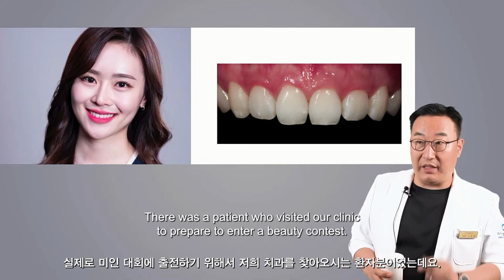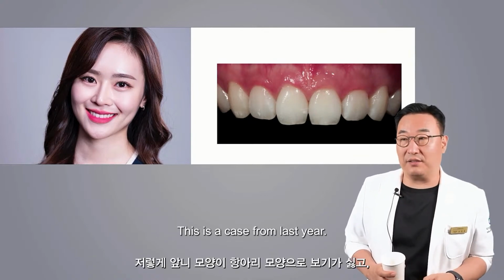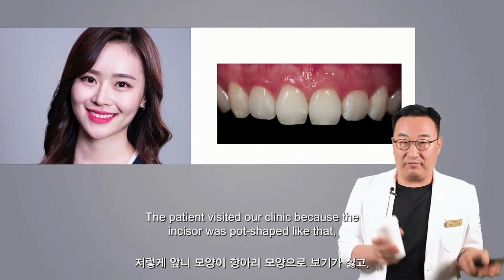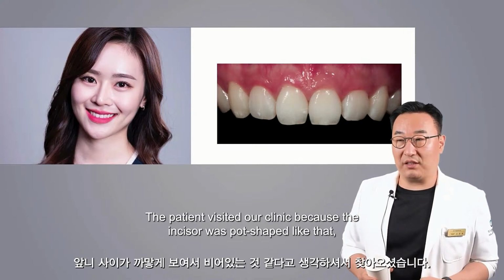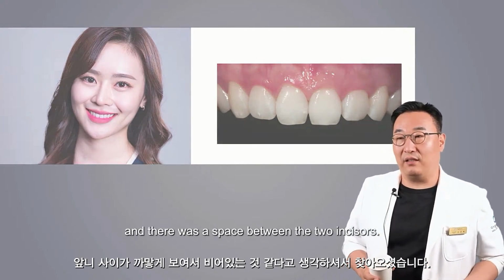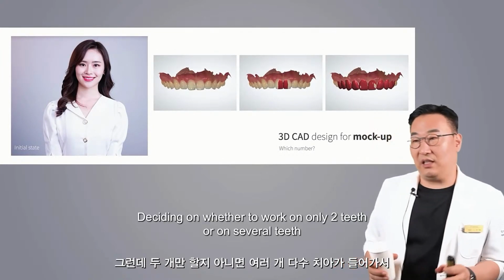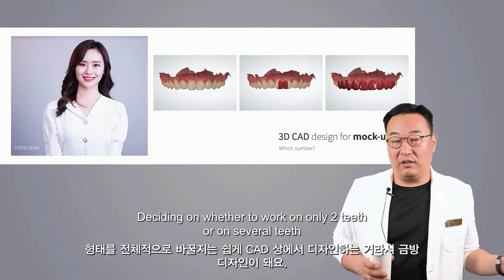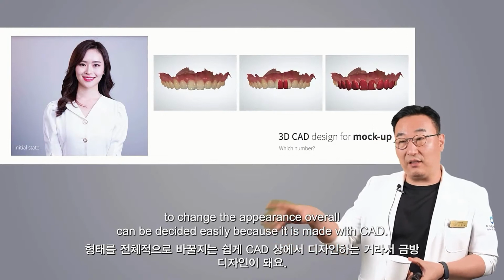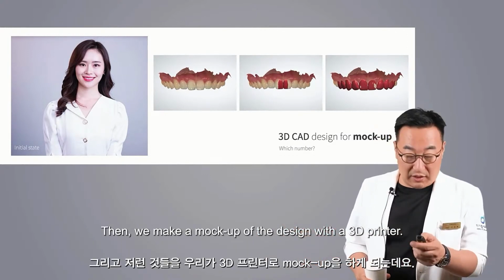There was a patient who visited our clinic to prepare to enter a beauty contest. This is a case from last year. The patient visited our clinic because the incisor was pot-shaped like that, and there was a space between the two incisors. Deciding on whether to work on only 2 teeth or on several teeth to change the appearance overall can be decided easily because it is made with CAD.